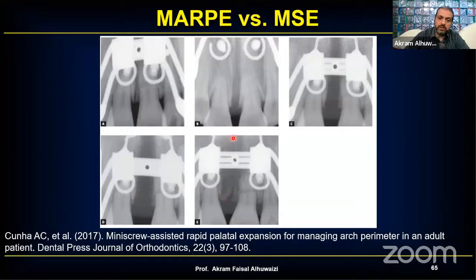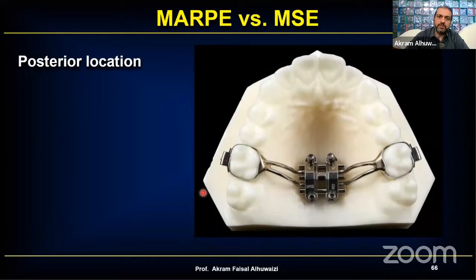And after some weeks, you get new bone, and the centrals just approximate because of the transseptal fibers. They all work the same anteriorly in the central region, but in the posterior part, they're not always the same. In the posterior, the maxillary skeletal expander goes posteriorly as much as possible, opposite to what I thought in case 2. In case 2, I wanted to go medially, but they said, no, you go posteriorly, although it offers more resistance, but this is the way. You have to go posteriorly.